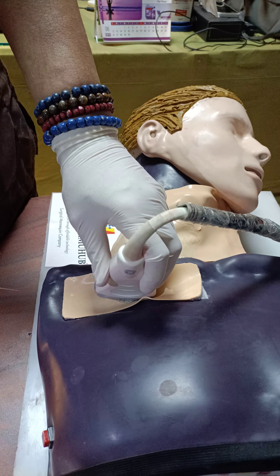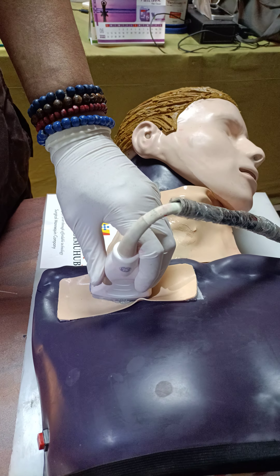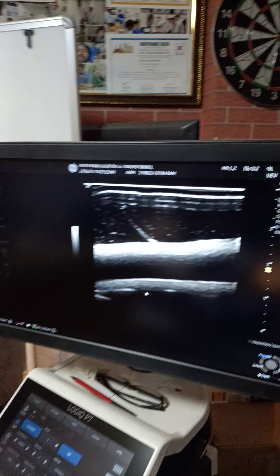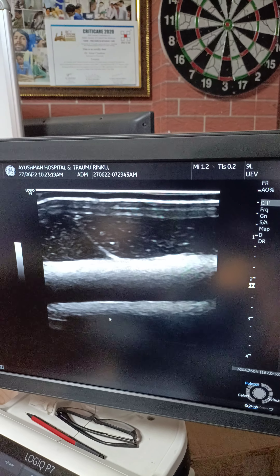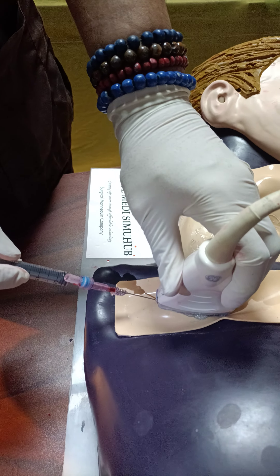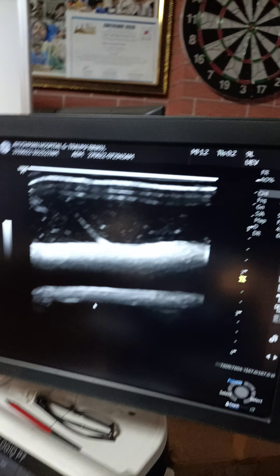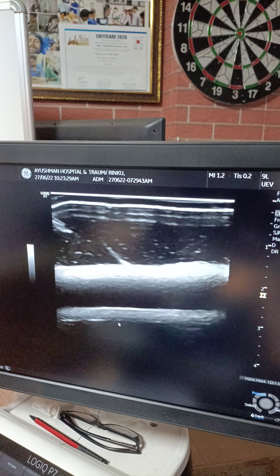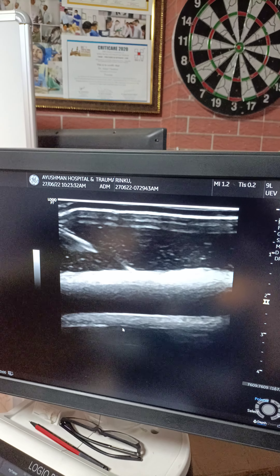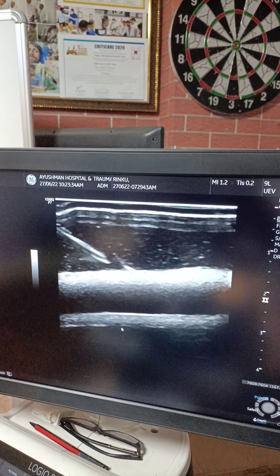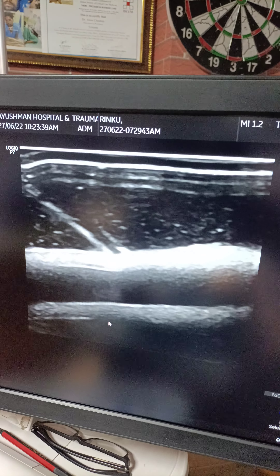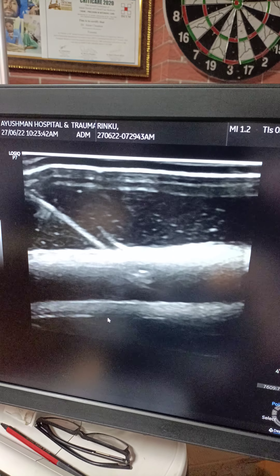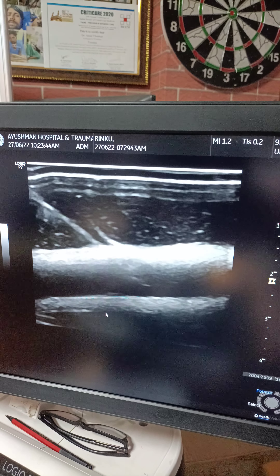Place the probe just below the clavicle to visualize the subclavian vessel — as you can see on the screen, this is our vessel. I will be demonstrating the in-plane approach. The needle is at an angle of 45 degrees. Focus on the screen — you should be able to see both the vessel wall and the needle. The needle is slowly advancing, and now it is hitting the vessel wall to enter the lumen. You can see the needle tip as it moves.